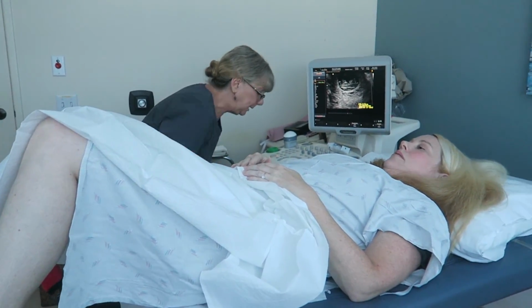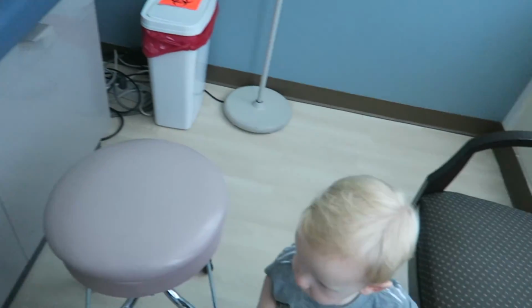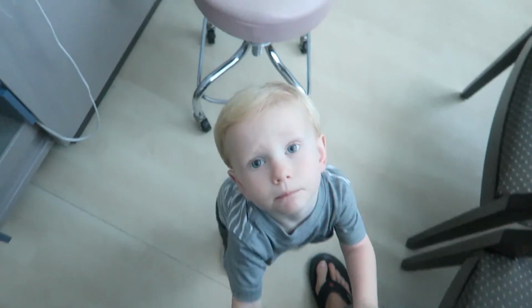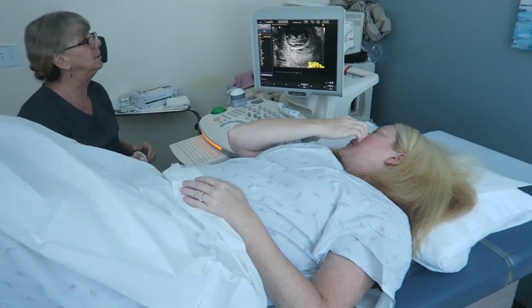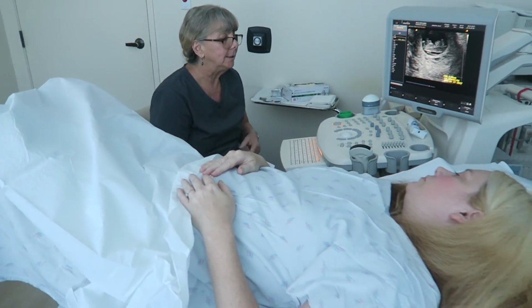Yeah. So, with ultrasound, we're looking at shades of gray. And basically, it's the brighter or the whiter, the denser, the harder. So bones would be bright, bright white. Black is fluid, and then all the grays are the tissues in between. The other feature of sonar imaging is that we're just seeing slices.